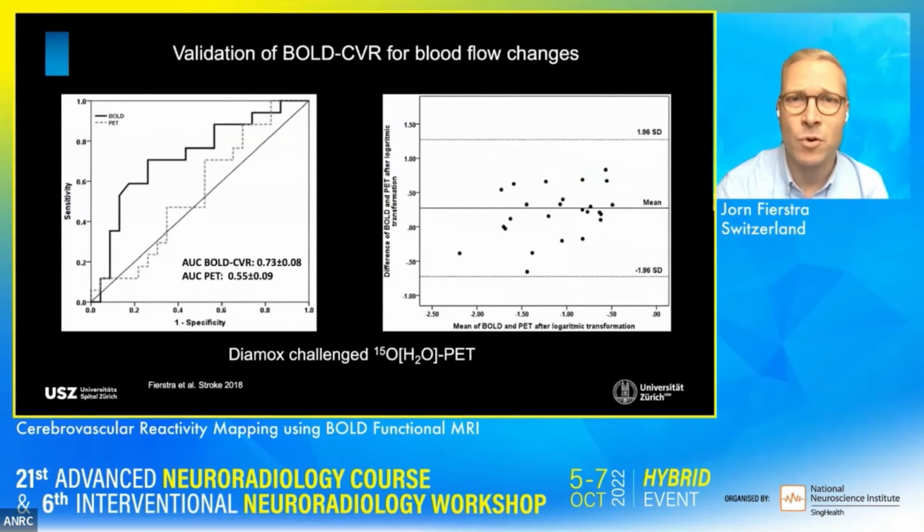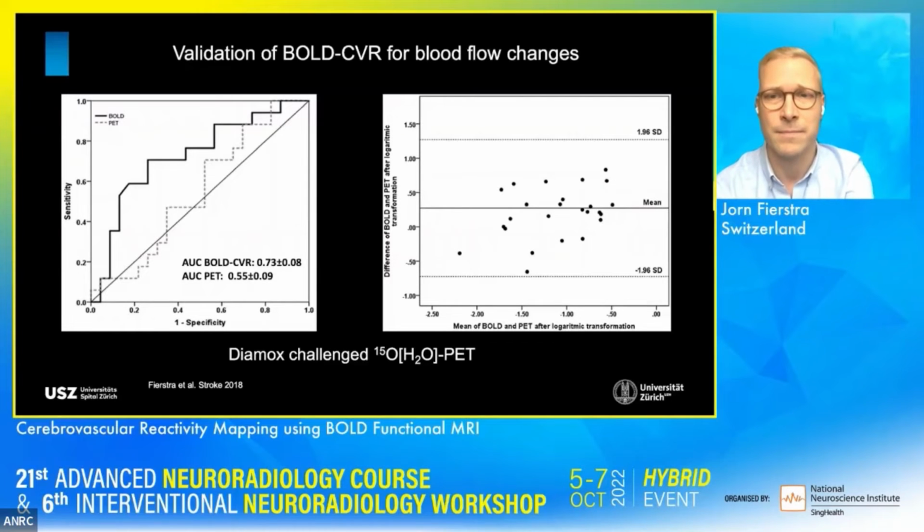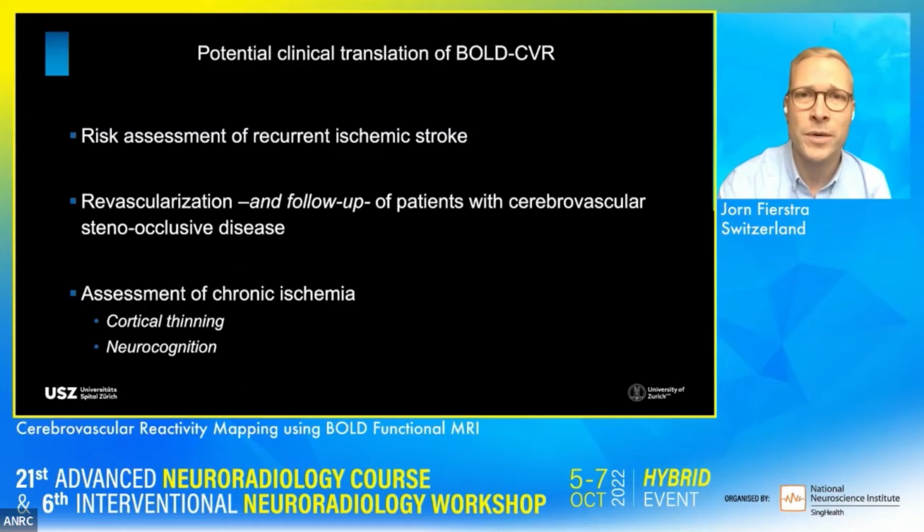That's why we compared our BOLD CVR, or validated it, against water PET. So Diamox challenged 15O-labeled water PET. And what we saw actually is that the performance of the BOLD CVR here in black is quite similar to the PET. And we actually have a very good agreement. So we can actually say that BOLD CVR could be a surrogate measure for cerebral blood flow changes in patients with cerebrovascular disease.